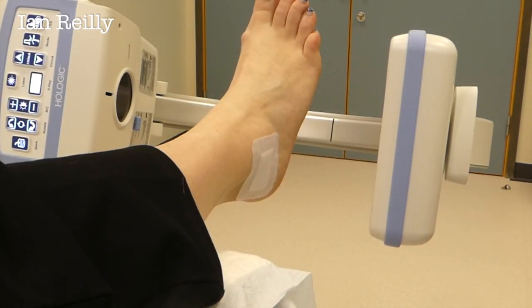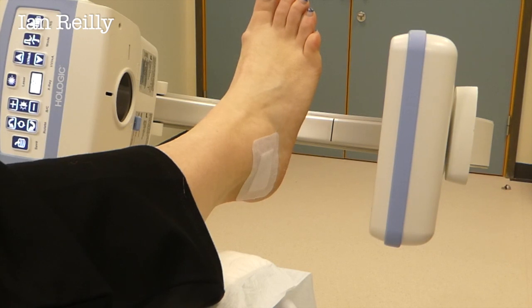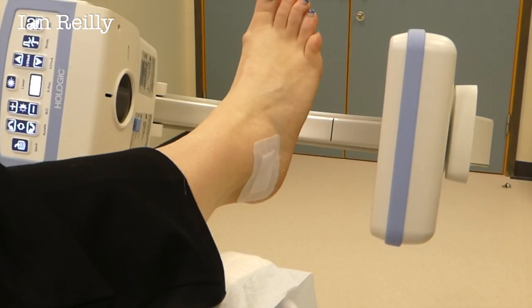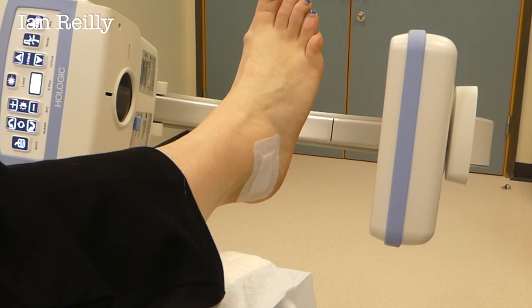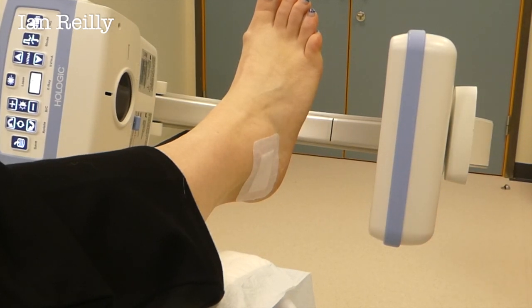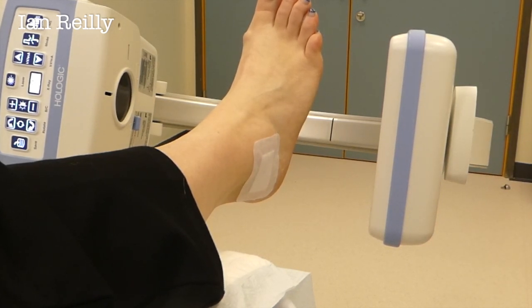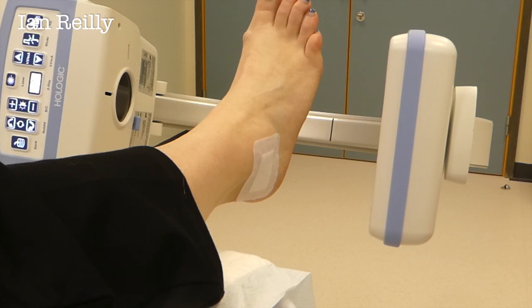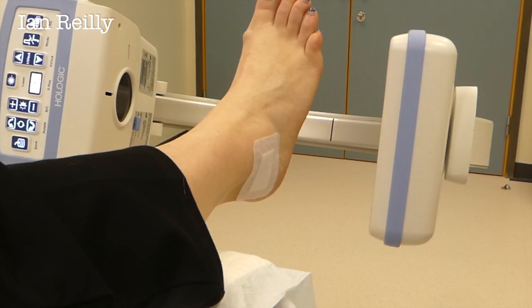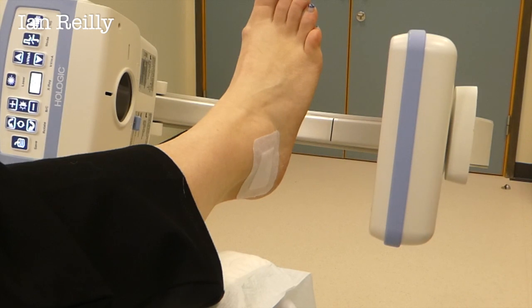So, Rita, we've used some local anaesthetic in there. The anaesthetic will take away the pain in the next couple of minutes, and if that takes away the pain, that says we're in the right area — so there's a diagnostic element to the injection. And then over the next two days to two weeks, we should get the effect of the steroid, which should give you some therapeutic benefit.